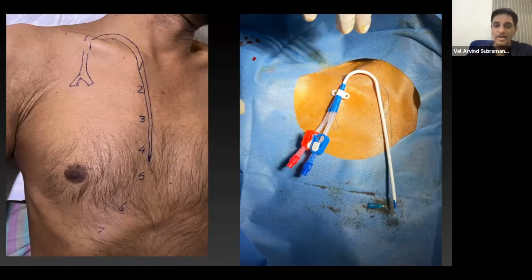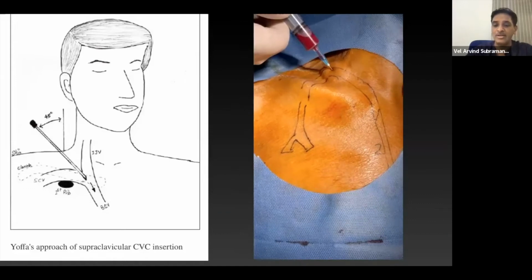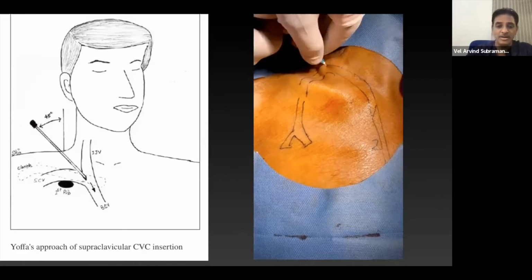And this is the way I count ribs, and I first pre-map the surface area. If you go in the anterior approach, this pre-marking may not be compatible with your position after the procedure. It may change, some kind of up and down position. But in this approach, what you draw on the skin, you will exactly see in the X-ray image also. So this is something I'm using, and I'm just pricking while sitting on the right side of the patient. I use a pathfinder needle.